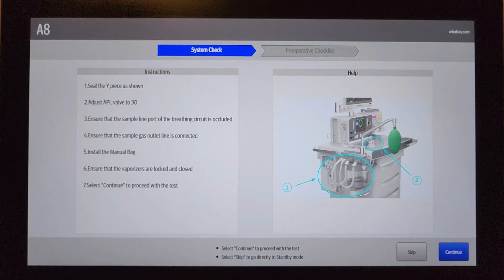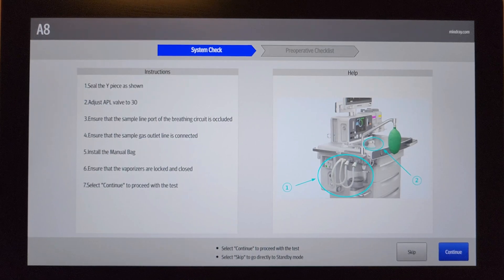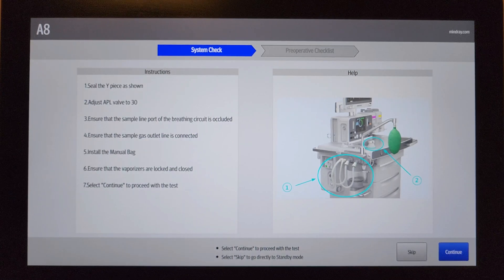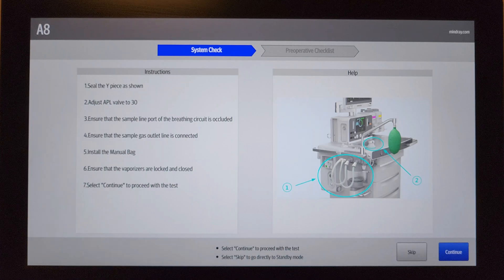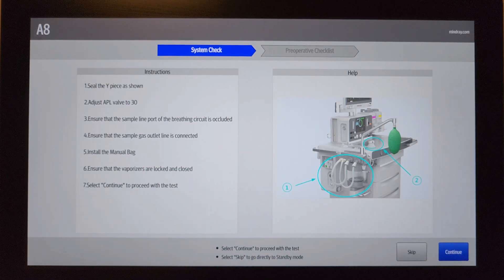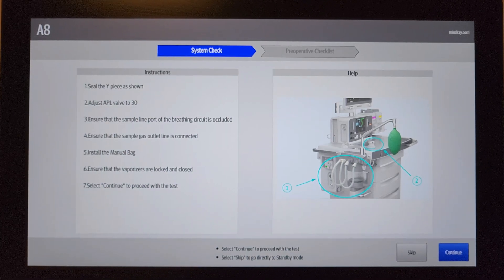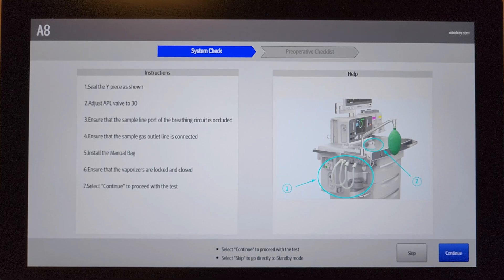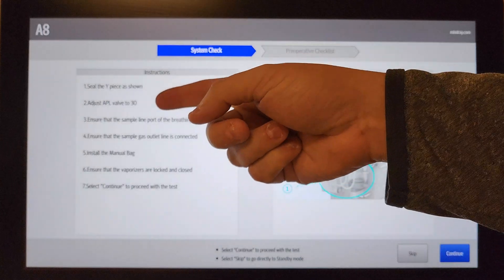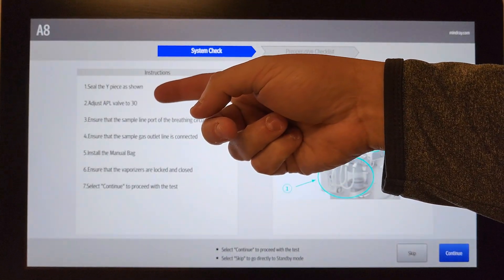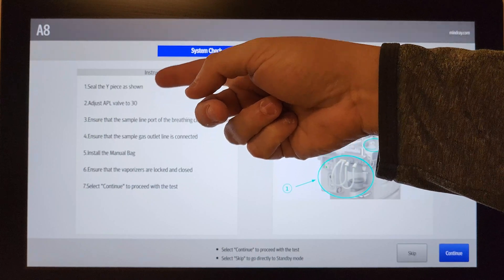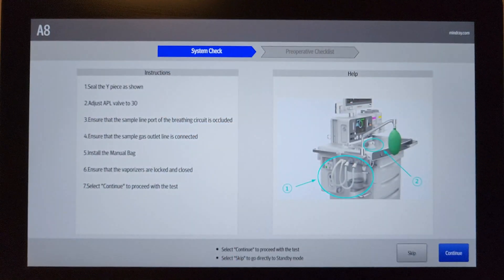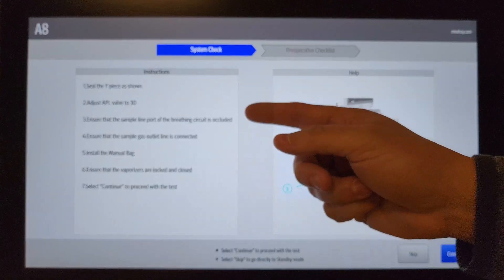Is take the pop-off valve and set it to 30. You can't really see what I'm doing with that just because I don't want to move the camera, it's perfectly centered on this deal. But you'll make sure you adjust the APL valve to 30.